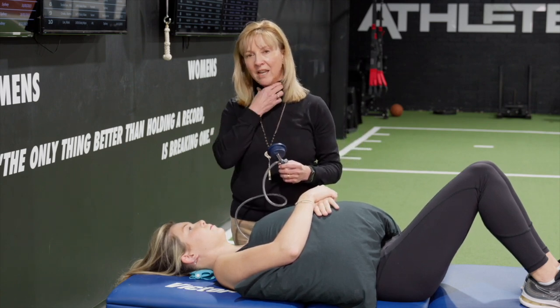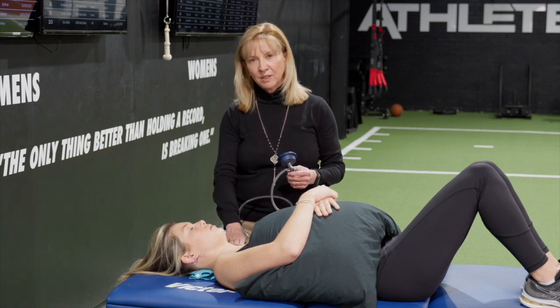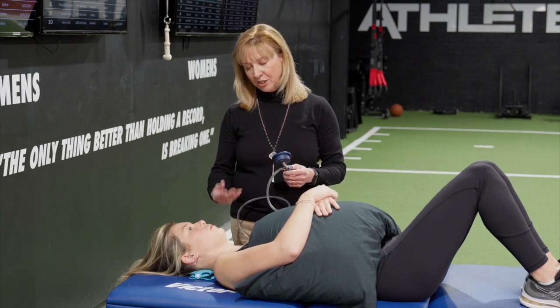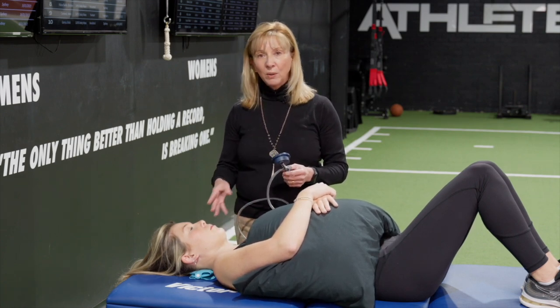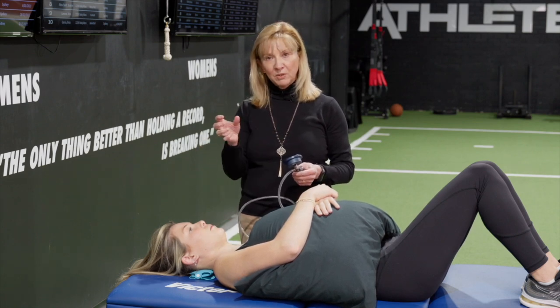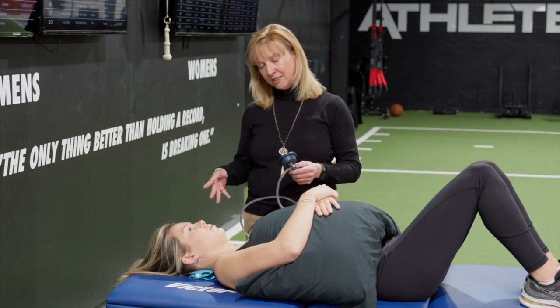Then they can go home and practice that, doing as many repetitions as they can, monitoring to make sure that she's not bringing those other muscles in. She should train quite quickly because she had reasonable control and reasonable movement up to 30. She was getting to sort of 24 — I would say that if she practiced this for a week or two, she'd be up to that next level quite quickly.